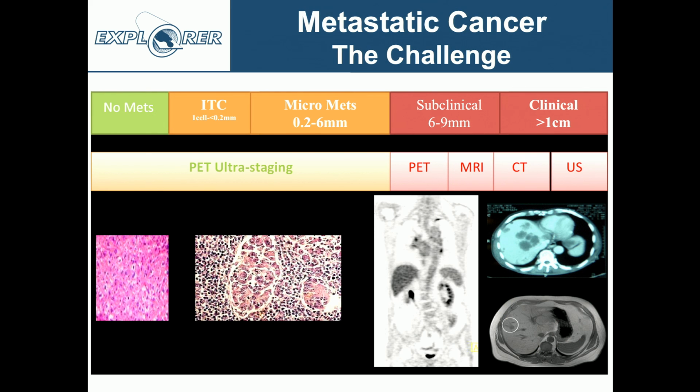So in the last couple of minutes that are left to me here, I'm just going to quickly go through a few possibilities. Cancer, as I mentioned, is one of the more obvious ones because it's where we currently use PET a lot. Right now, we tend to be looking at lesions in the range of 6 to 10 millimeters or so with PET. And the question is, how far can we push back into the micrometastatic realm?